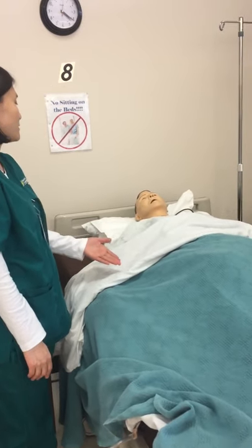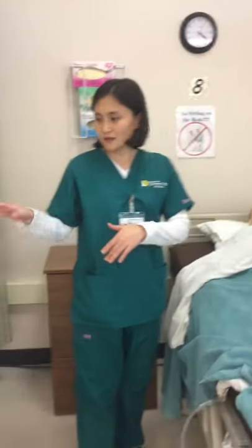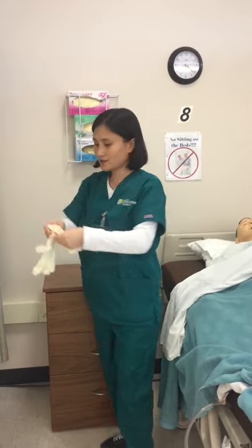Explain the whole procedure to the patient. Gather all the supplies. Perform hand hygiene. Apply gloves.